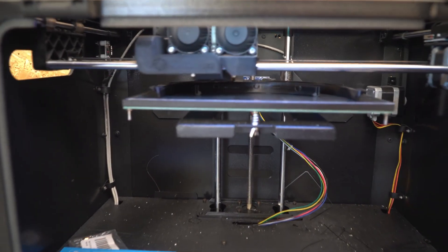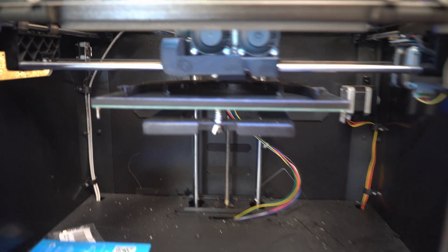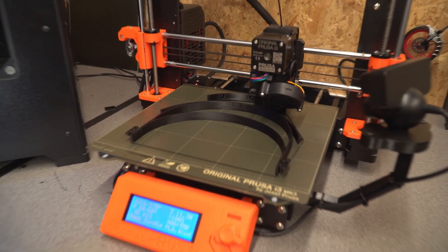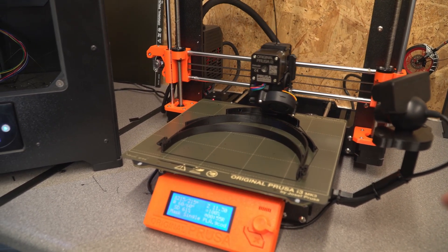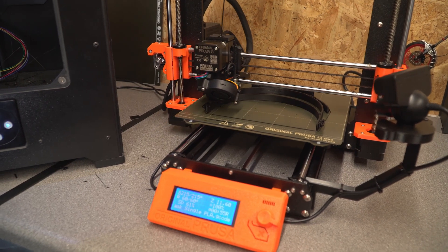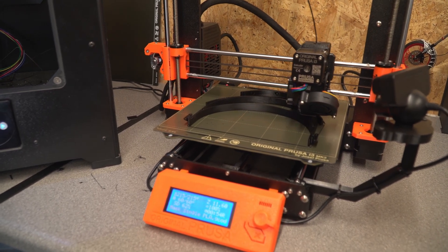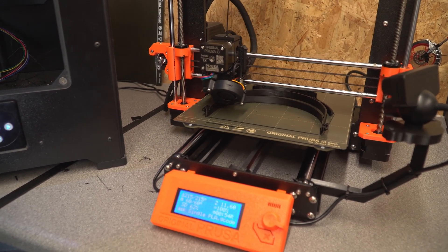Moving over to the Flashforge, you can see it's printing the masks one at a time, and it's also got the lower part of the shield as well. Moving over to the Prusa, it's also doing them singly. Originally with the Prusa I was printing in PETG using a special fast file that Prusa made - I was able to print two masks on the same bed in about the same time it takes to do one at normal speed. They do a stacked version too, but two masks on the same bed at fast speed was very efficient.